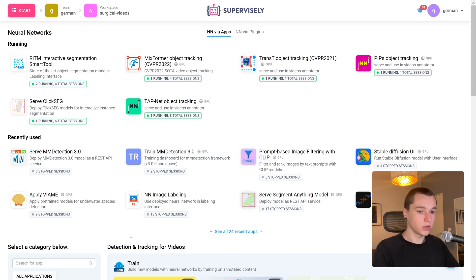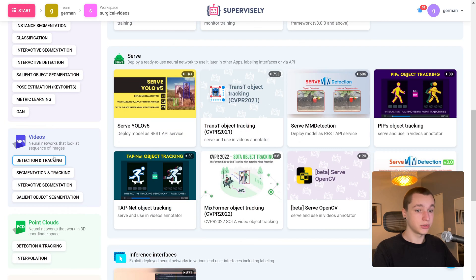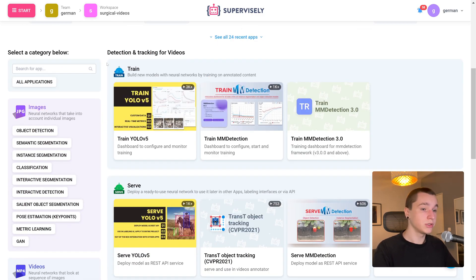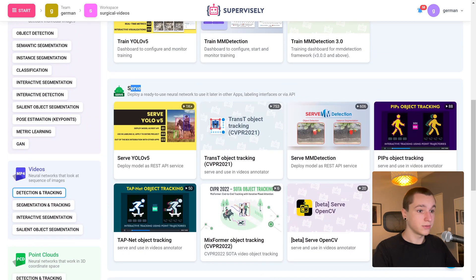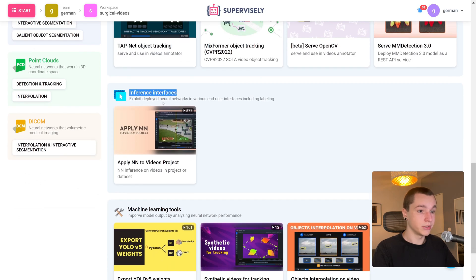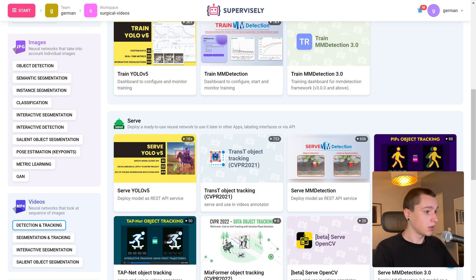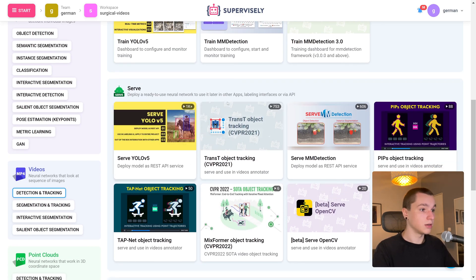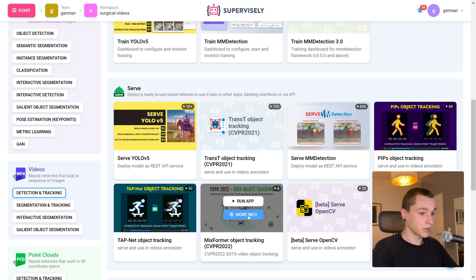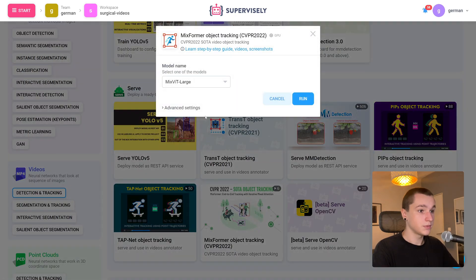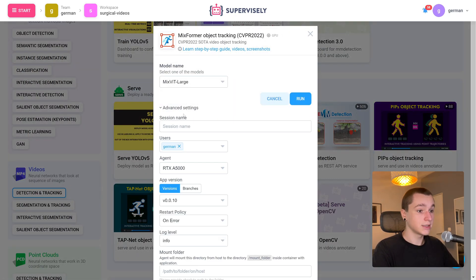Let's find them. First is tracking — we need to go to Videos and find Detection and Tracking. Here we have several categories for neural network applications: first is Train, second is Serve, then the inference interfaces, and lastly machine learning tools. We need the Serve category. Here we have quite a few models — I'll choose MixFormer object tracking. Let's click Run App and go to the advanced settings.